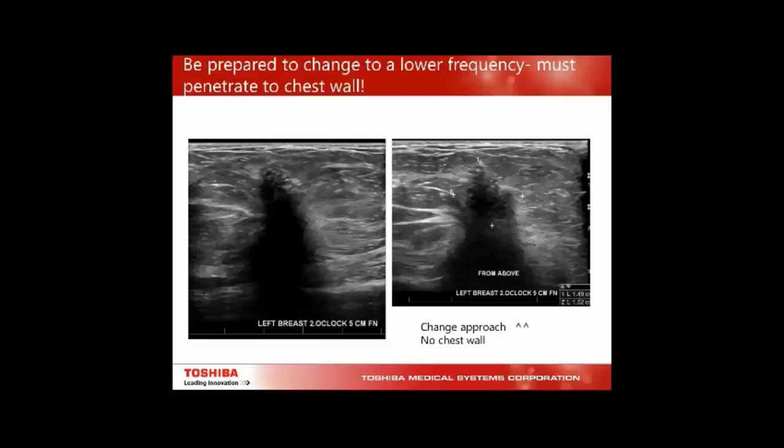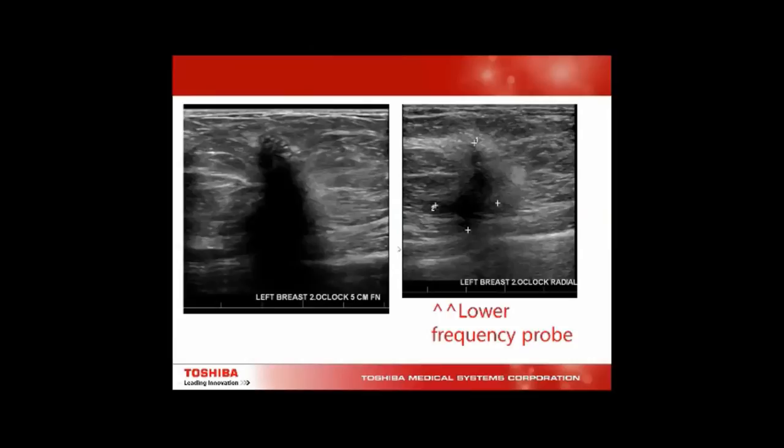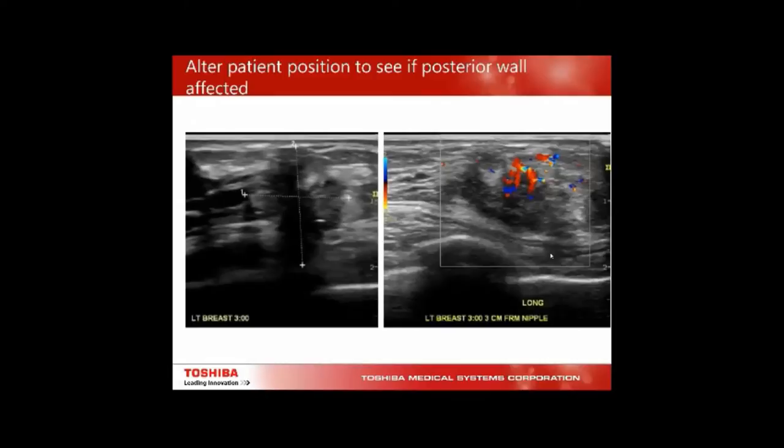This looks like granulomatous tissue; we've lowered the frequency and come from above but still can't see below. Going to a 9 MHz probe, we can actually see the desmoplastic reaction around the lesion. Ultrasound is performed supine, making things look like they're affecting the chest wall — unlike MRI done prone or mammogram that pulls the breast away. Rotating the patient can reveal that a lesion appearing to involve the pectoral muscle actually isn't, helping with surgical planning.